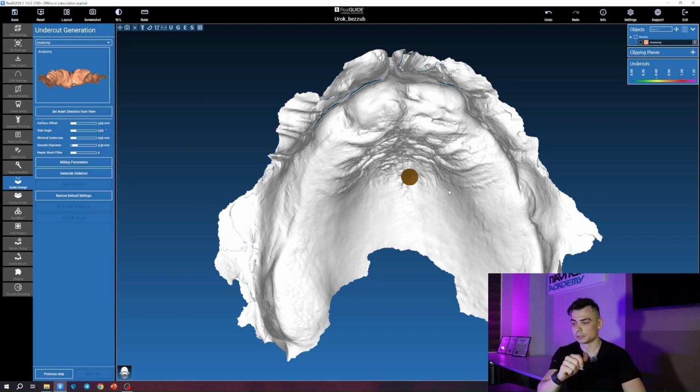And the second point is that it's quite convenient from a logistical point of view, because it doesn't matter whether you have a scan, whether you don't have a scan in the clinic, whether you have impressions. Well, everyone has impressions. Basically, all you really need is an impression, and a plaster model. So it doesn't matter whether you have a CT scanner in your clinic or not. You can give this to the patient. The patient will take it, go get a CT scan, and basically everything will work out for everyone. This method has stood the test of time, and that's exactly what we're talking about now.